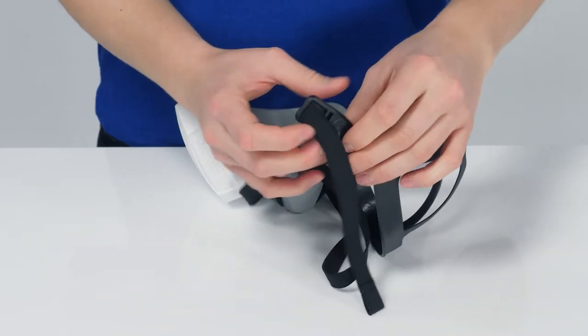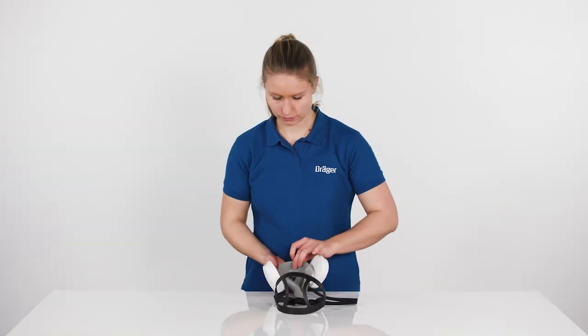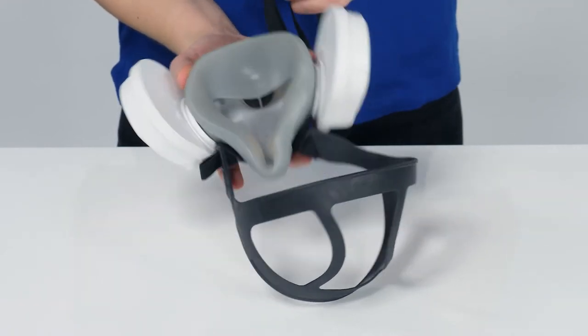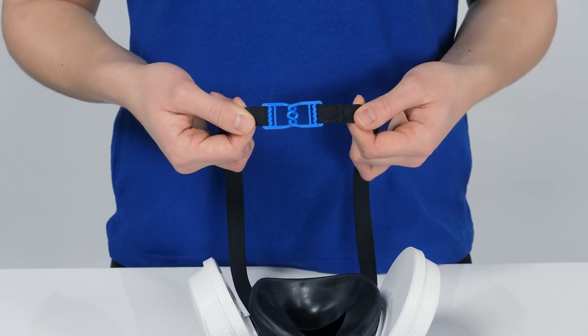For easy donning, draw the buckles of the head harness up to the end of the harness. Pull the neck strap through completely until the buckles of the head harness touch the yoke of the half-mask. Close the clasp of the Explore 3500 half-mask version.